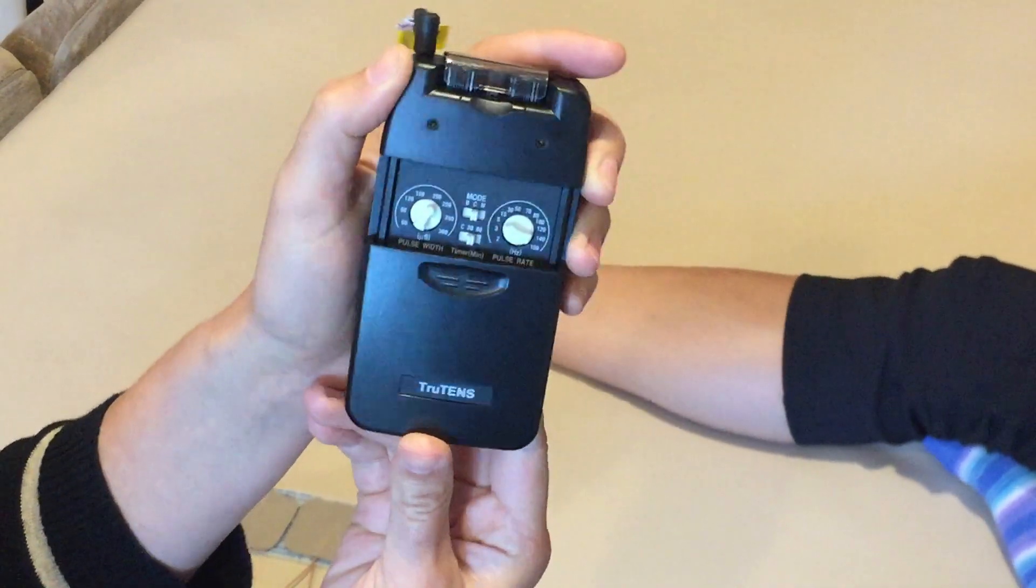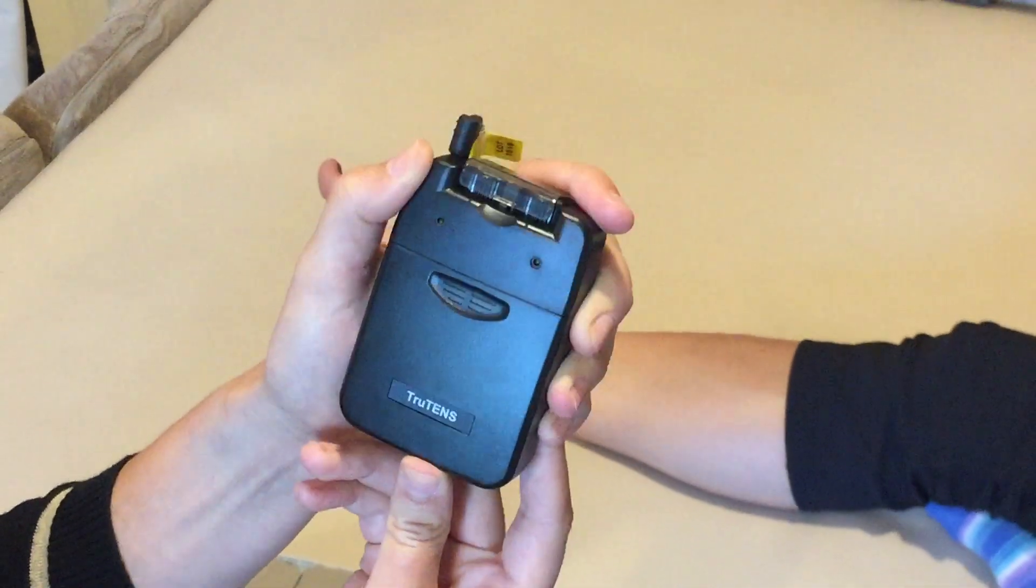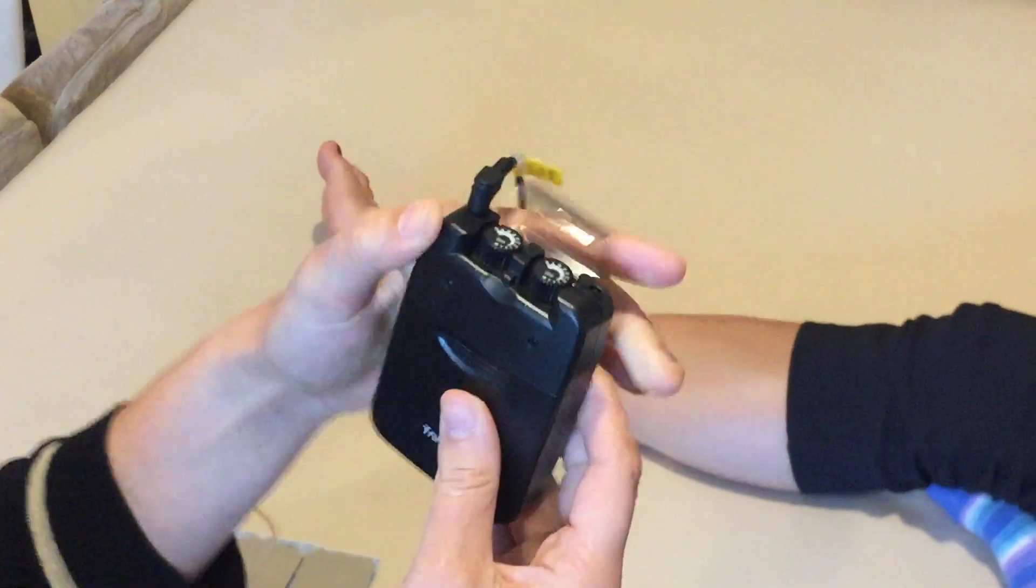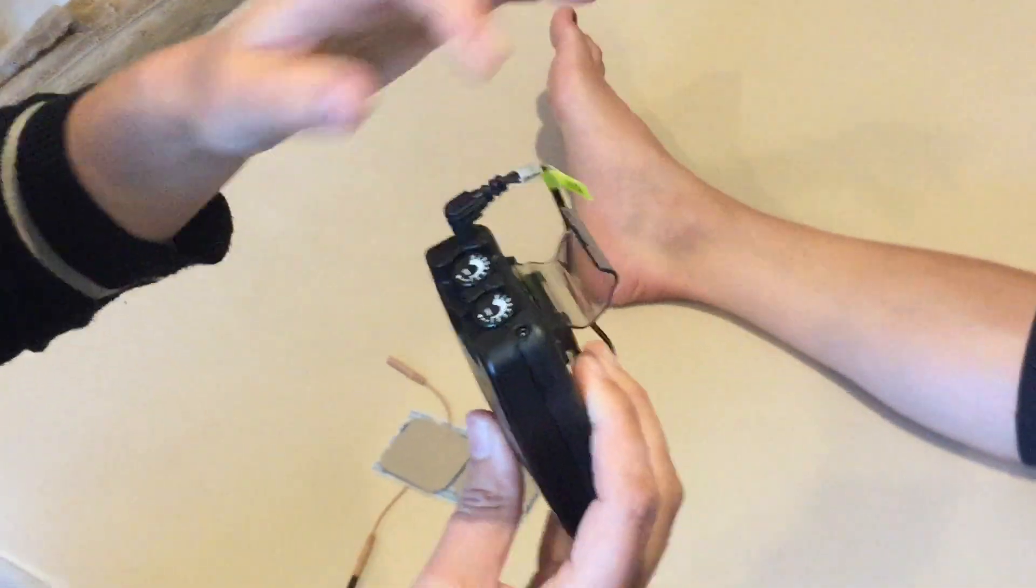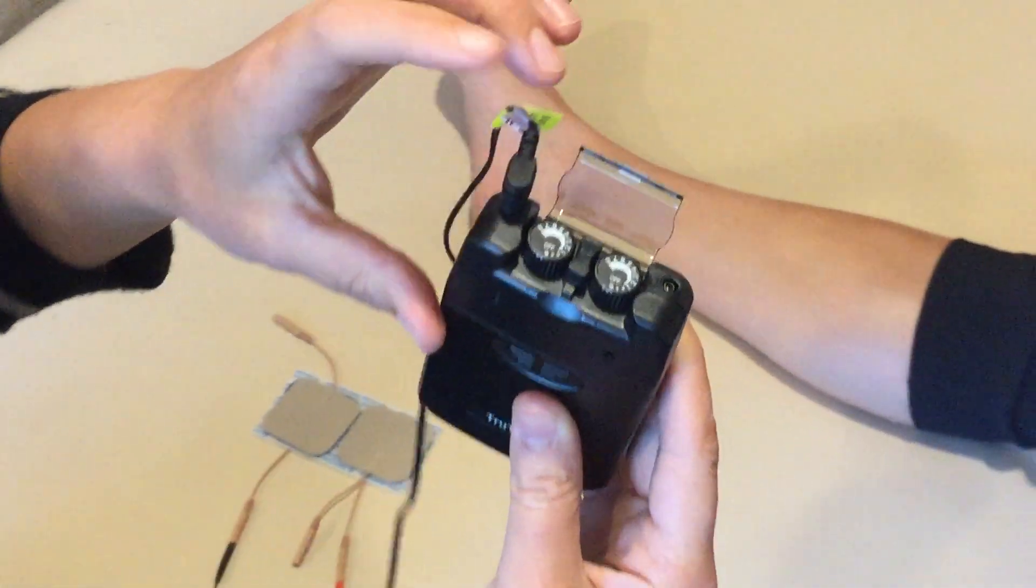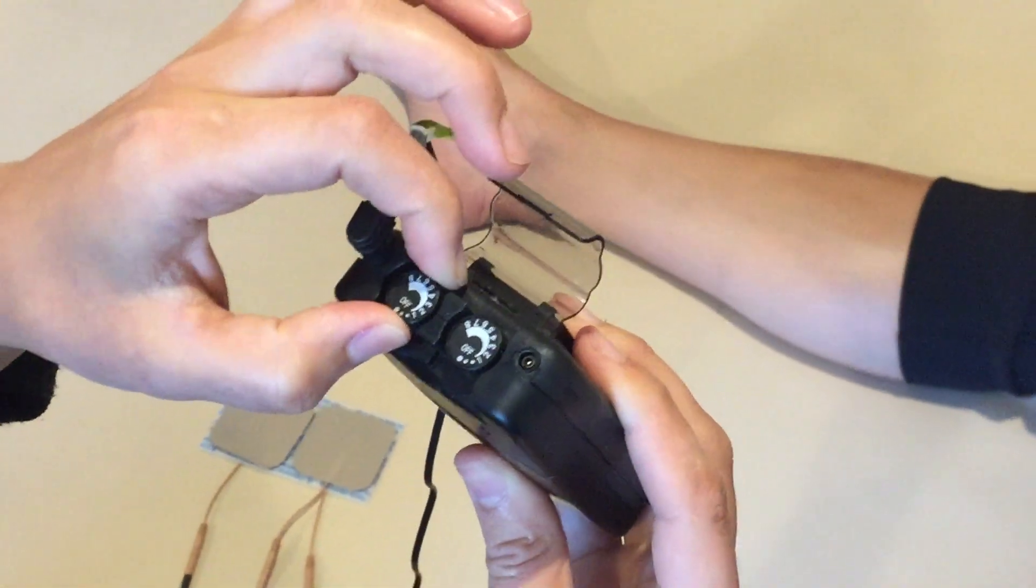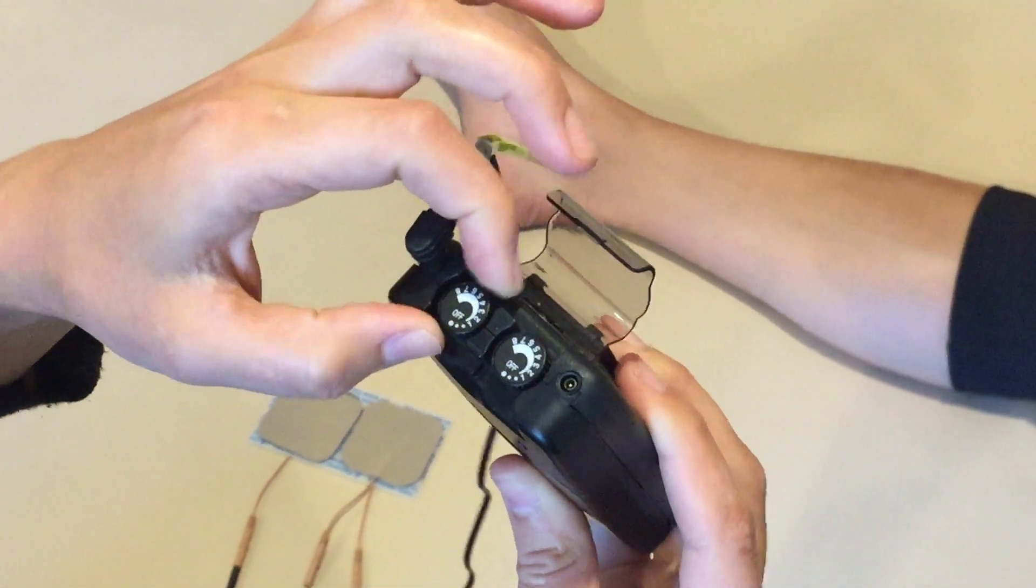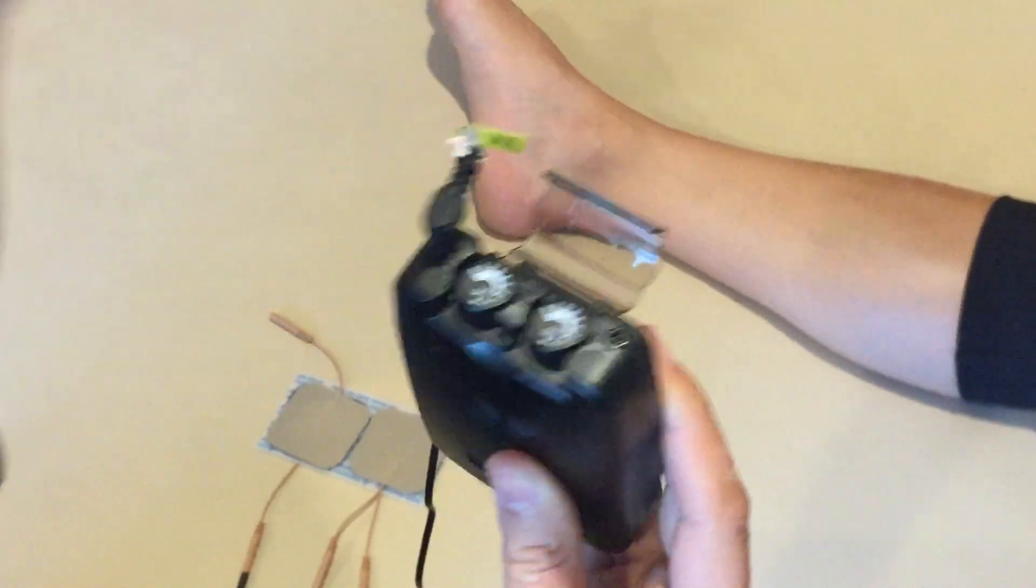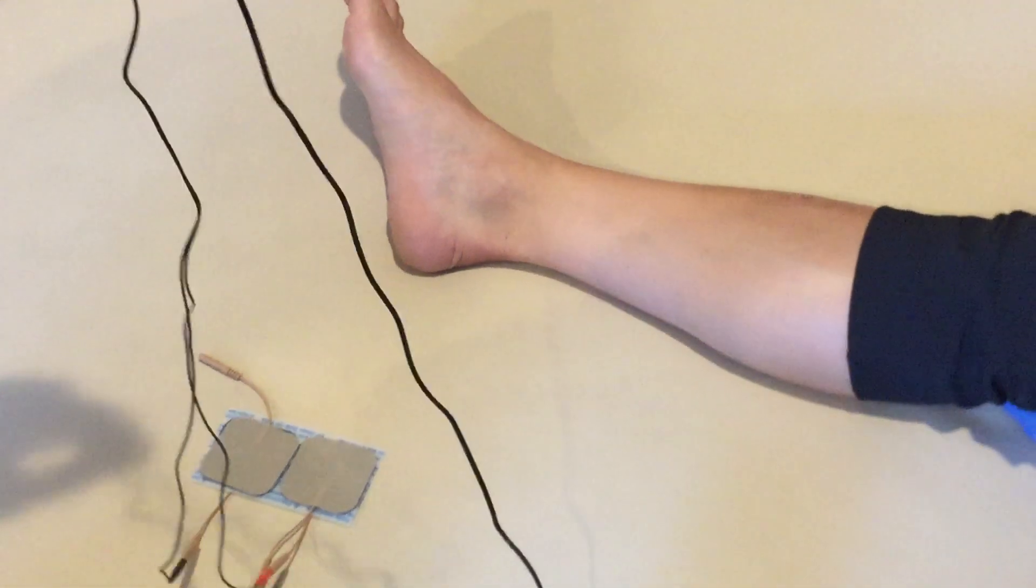Once you have your control set you can slide that back closed and then whichever side is plugged in is the dial you'll be controlling. So we have the left dial, we want to make sure it's all the way off before we set our electrodes.